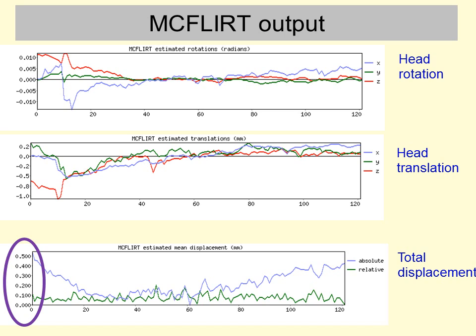That's a pretty good participant. If someone has on the total displacement plot values of less than 1, that's pretty good. If you see 3 millimeters as the maximum on the total displacement plot, you would start to worry about that participant as a rule of thumb.